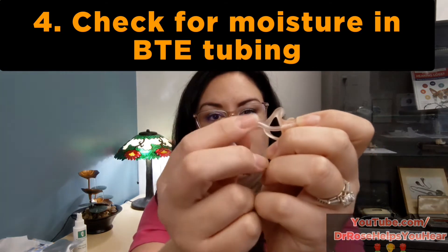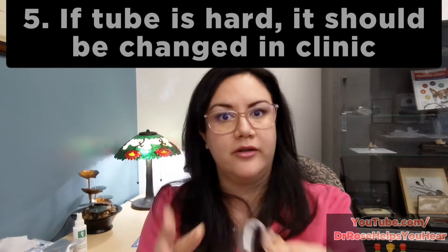For behind-the-ear hearing aids, sound travels from the receiver at the top of the aid all the way down the tube and into your ear through an ear mold. Sometimes moisture bubbles pull inside the tube and completely stop the sound. Also, if the tube gets hard, it will stop some of the sound. You should see your hearing care professional for a tube change every three to six months, depending on your skin's pH. If you can't pinch the tube together, it definitely needs to be changed.